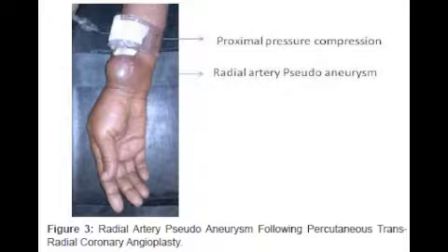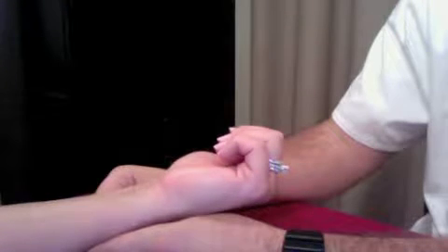There are other complications related to this access, as well as a higher risk of spasm on entry, and since the arteries are smaller, it can be more difficult to manipulate the catheter as needed during the procedure.